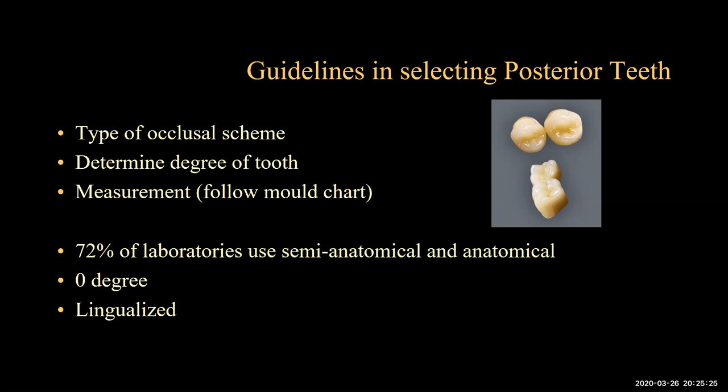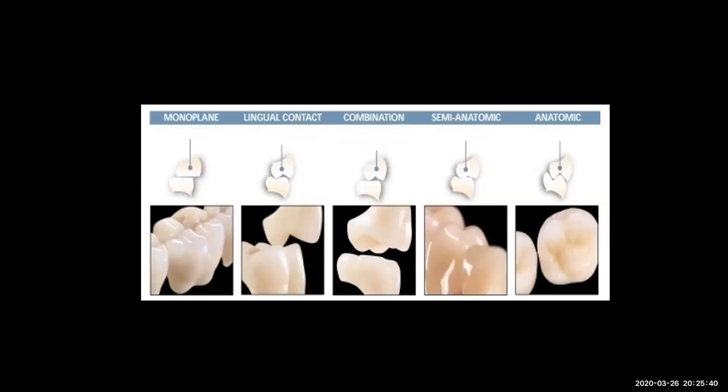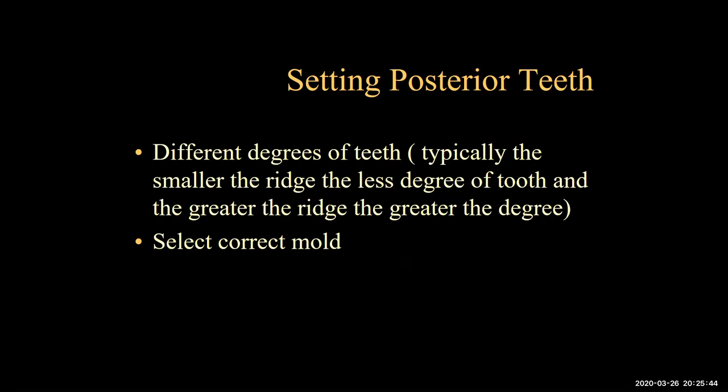And then on a lingualized aspect, which we'll get to in a minute, that is usually utilized on the implant cases that we do, for lingualized occlusion. And we do use it on full cases also, and I'll elaborate on that in a few minutes. There are just different occlusal schemes, so we have a bunch to choose from, and different degrees of teeth. Typically, the smaller the ridge, the lesser the degree of the tooth, and the greater the ridge, the greater the degree of the tooth. In other words, the greater the cuspal inclination of the tooth.